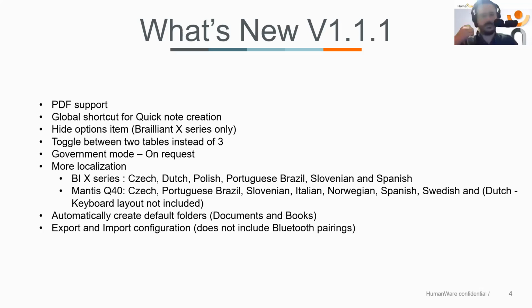So if you don't use computer Braille, for example, you can actually select none. If you do select none, then it will allow you to toggle between just the two Braille tables, the contracted and the uncontracted. So it's a good way for Braille learners who are trying to learn contracted Braille. You can switch between uncontracted and then contracted without computer Braille getting in the way.